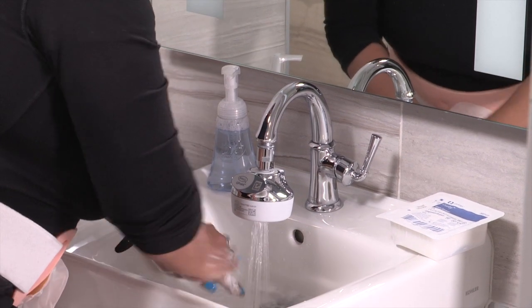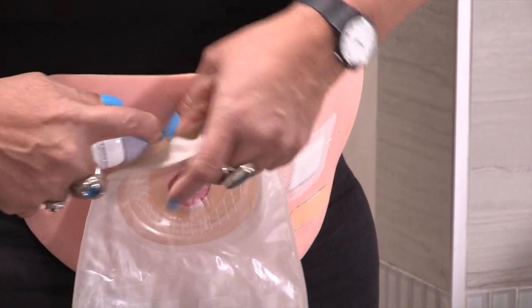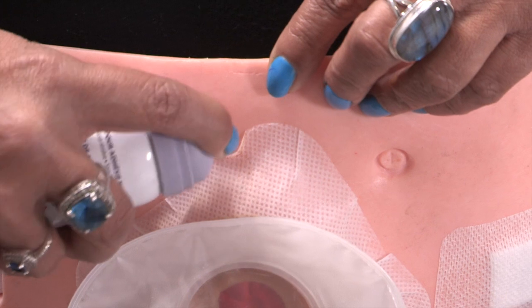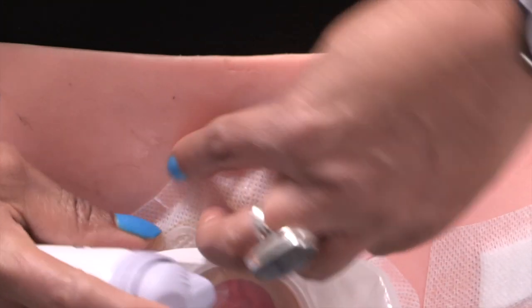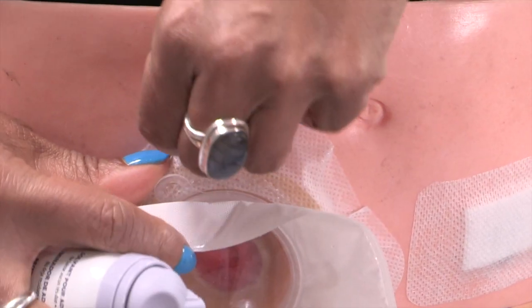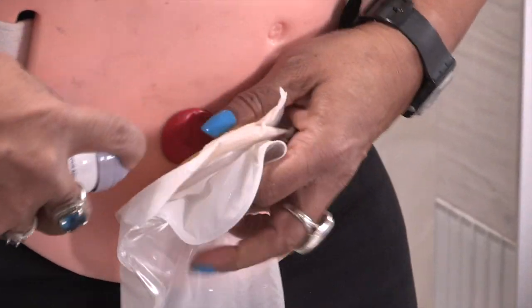After you empty the pouch, you can take the pouching system off — you will remove the wafer and pouch together. The skin around your stoma is sensitive, and it's important to be gentle. Don't pull the wafer straight away from your skin. First, spray the adhesive remover over the wafer. Press down on your skin with one hand. With your other hand, gently lift an edge of the wafer and roll it away from your skin. Then spray more adhesive remover spray underneath as you go.